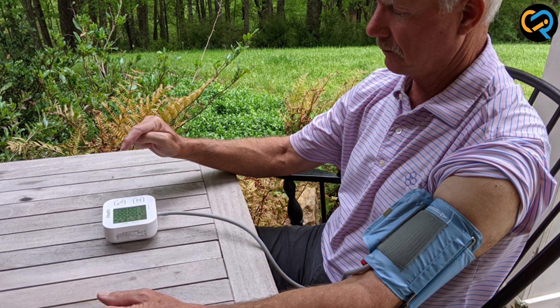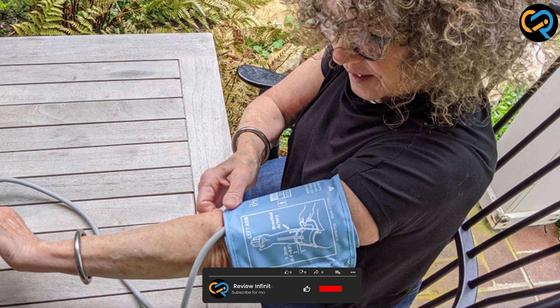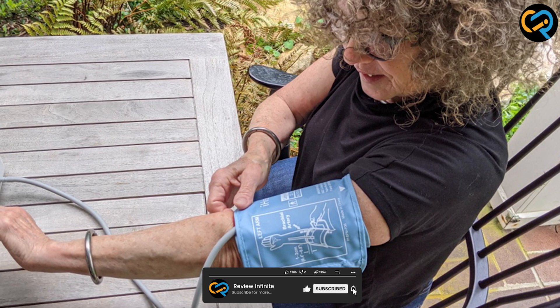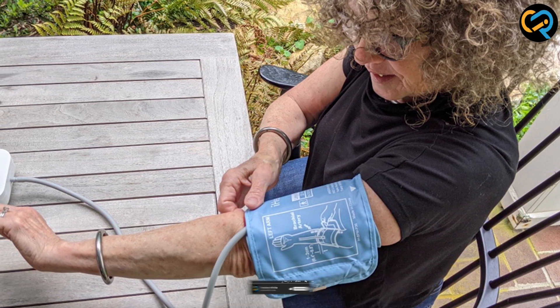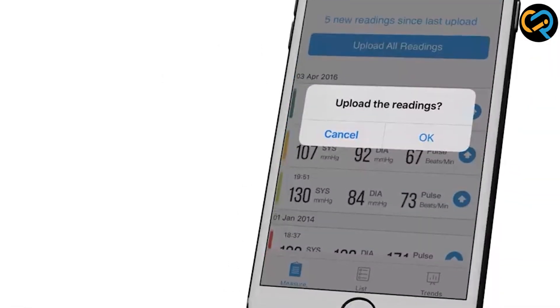To take a reading, all you have to do is wrap the cuff around your upper arm and press the start button on the device. The cuff will inflate automatically, and the device will take your blood pressure and pulse rate readings. Once the readings are complete, they will be displayed on the LED screen as well as on the app.